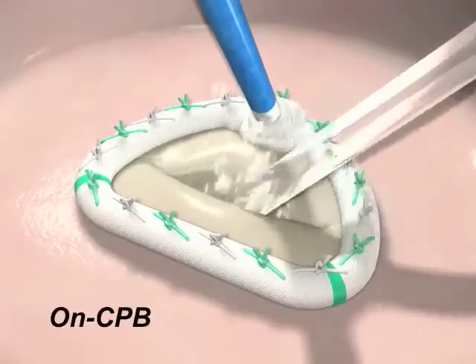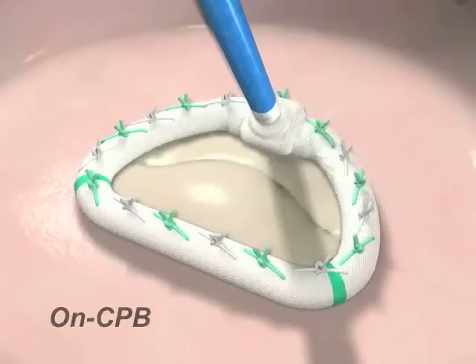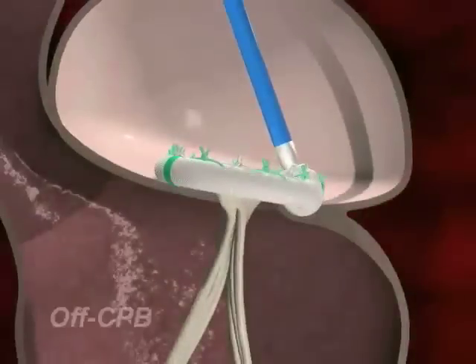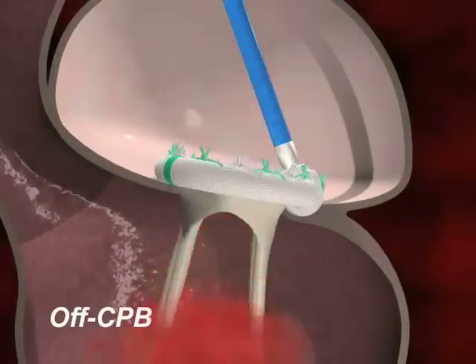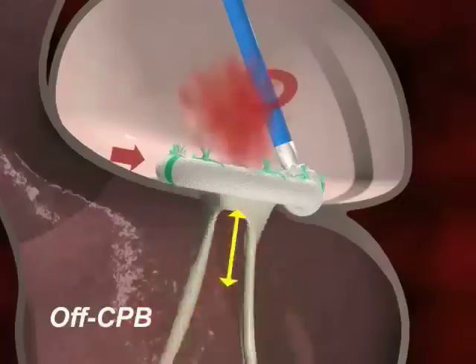Leaving the adjustment tool in place, the left atrium is closed and the heart is taken off cardiopulmonary bypass. Echocardiography is used to evaluate for any residual regurgitation or insufficient coaptation of the valve leaflets. Adjustments to the size of the ring can be made off pump on the beating heart.